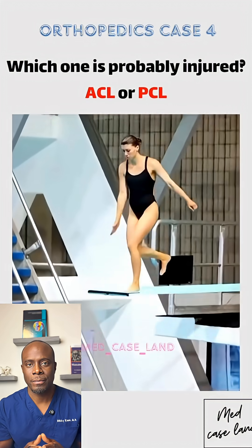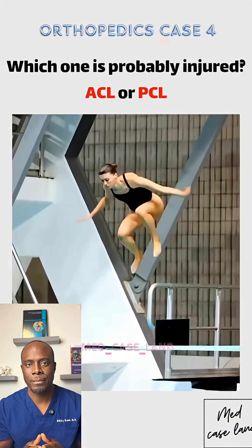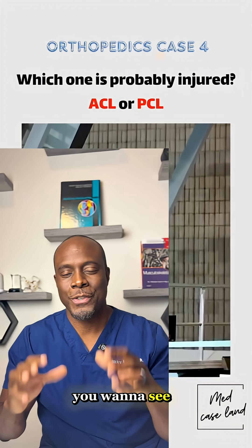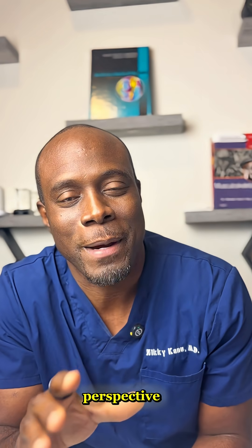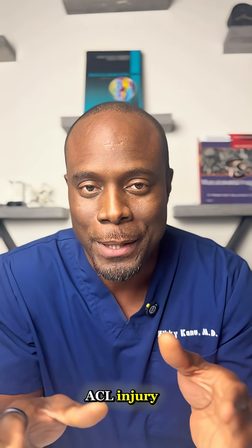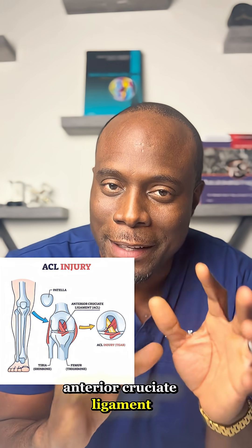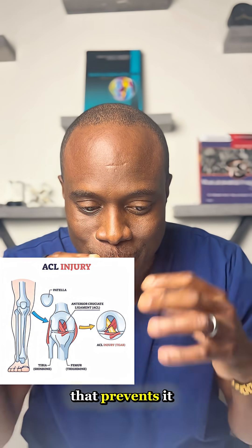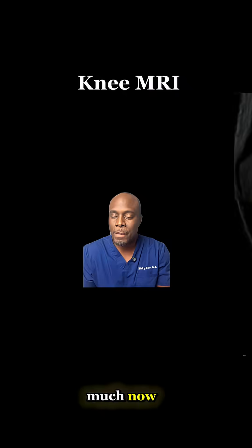Open up the door, can you? And I'll be sick. You want to see what that looks like on MRI from a radiologist's perspective? Come on. So it's likely an ACL injury. ACL stands for anterior cruciate ligament. It's one of the main ligaments in your knee that prevents it from sliding forward or twisting too much.